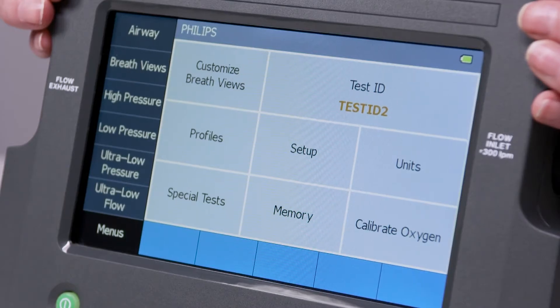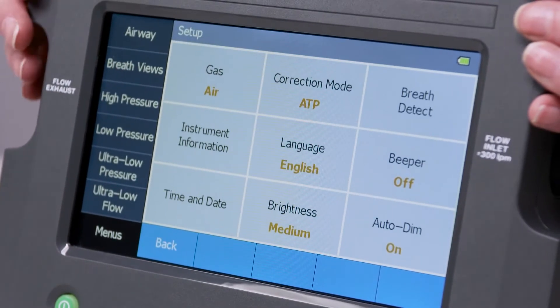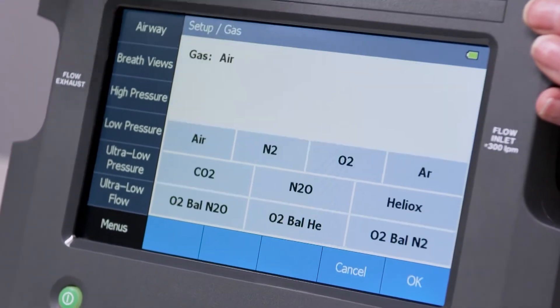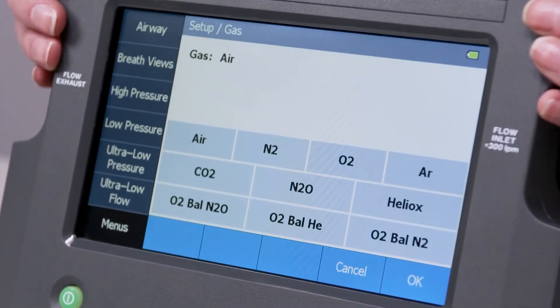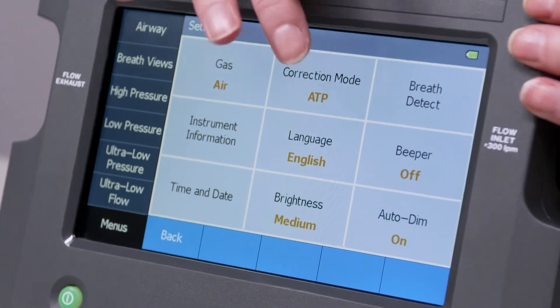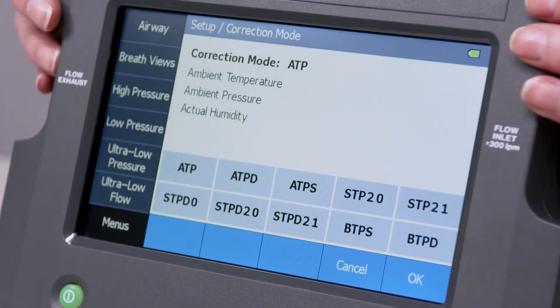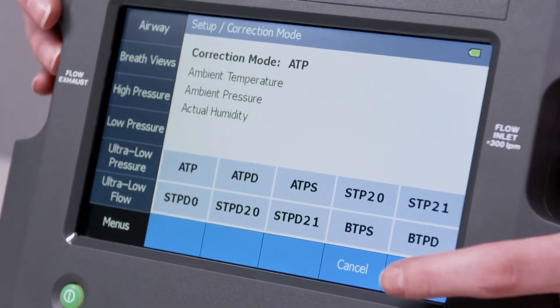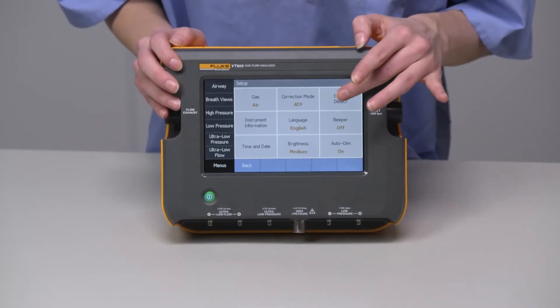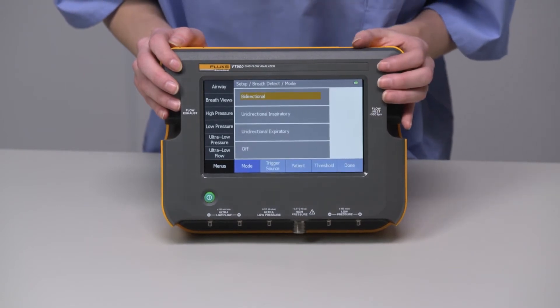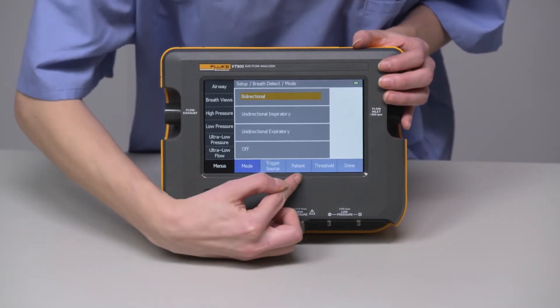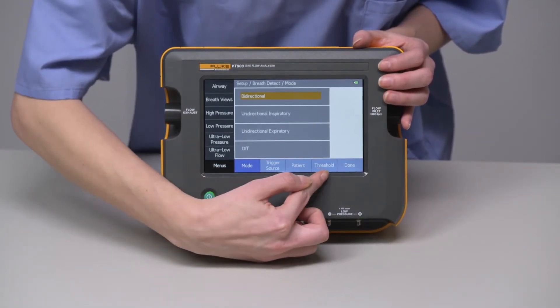Let's start with the setup. This is where you change your gas type, correction mode, and breath detection, with trigger input, patient type, and set thresholds.